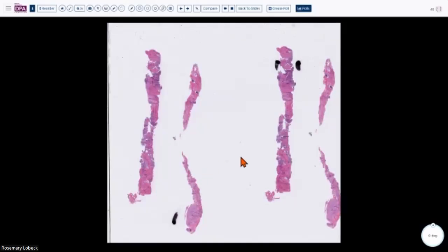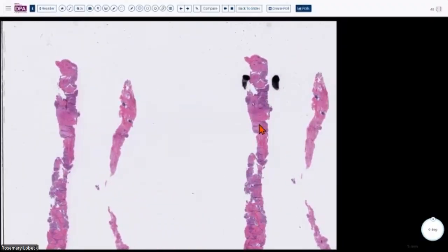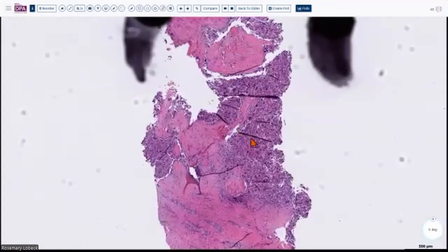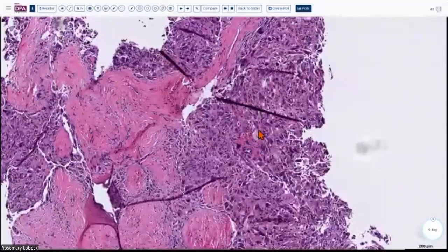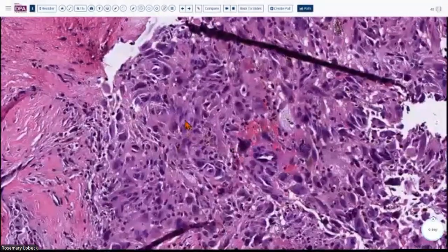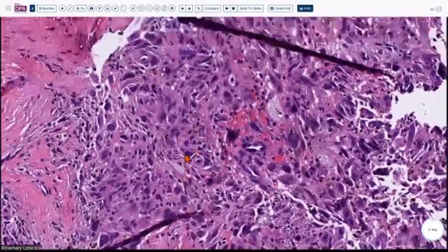So here is a needle biopsy from this particular mass. And as you can see, most of it is fibrotic, but there are also some cellular areas, right? So let's zoom in on the cellular areas. Even before I go any further, you would have noticed that this lesion is highly bizarre, with highly pleomorphic cells, right? So much variation in nuclear size and shape, and you have a lot of hyperchromasia, right?